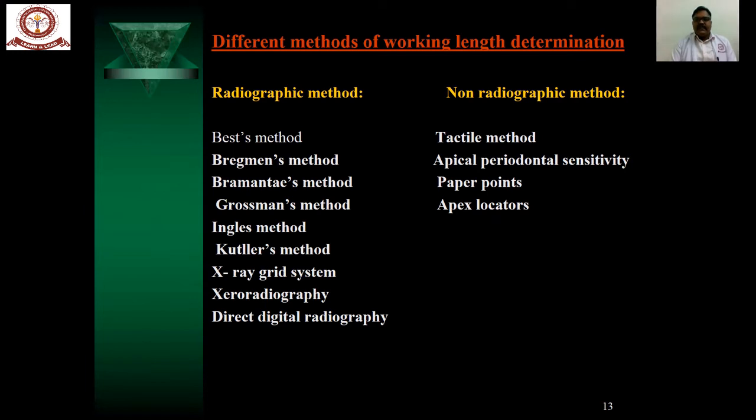In non-radiographic methods, we use tactile sensation, apical periodontal sensitivity, paper points, or electronic apex locators.